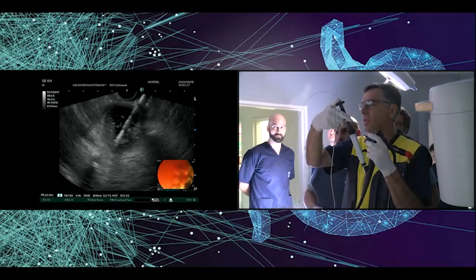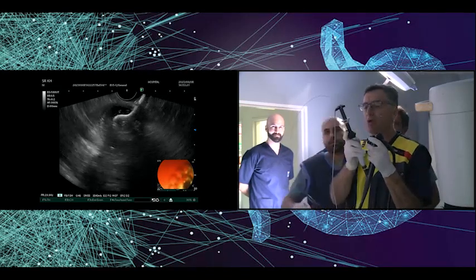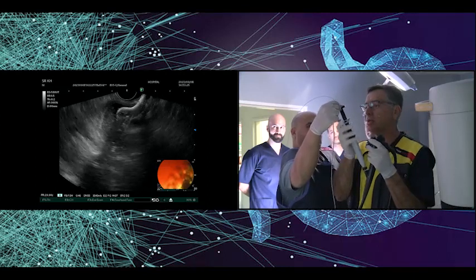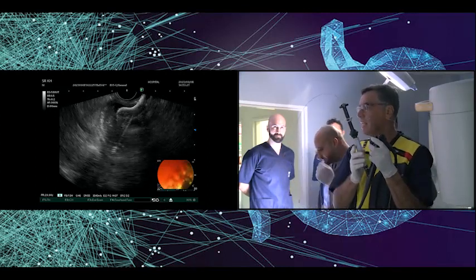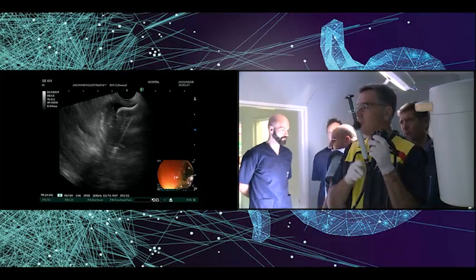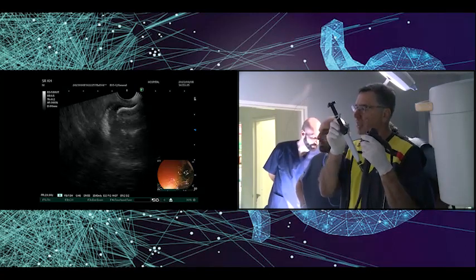Okay, this is the release of the distal flange. You see it now? Okay, so I will pull back a little bit. Okay, you disconnect. Okay, okay. And now I will move to the endoscopic part. I hope you have the endoscopy, you see?